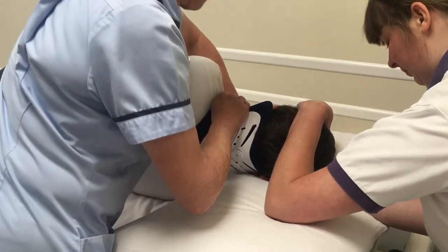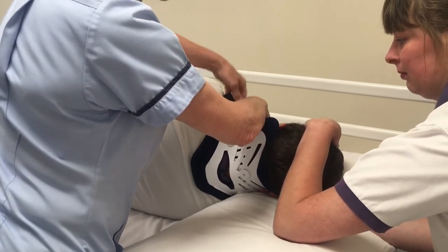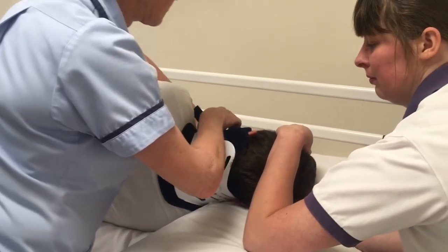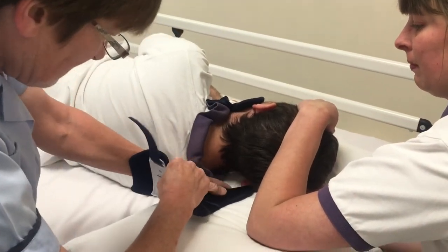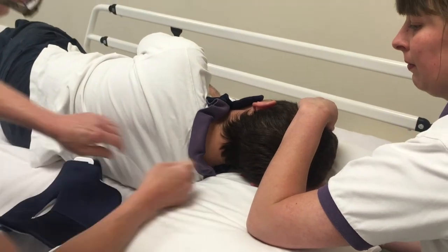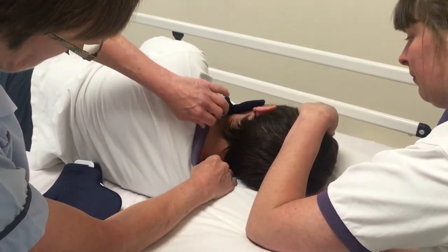We're now going to remove the back of the collar. I am doing the velcro strap from the front, and if appropriate you can ask your patient to give some support to the front collar. You can then slide the back collar out and apply personal care to the neck area.